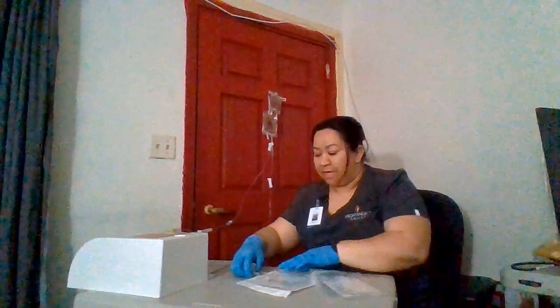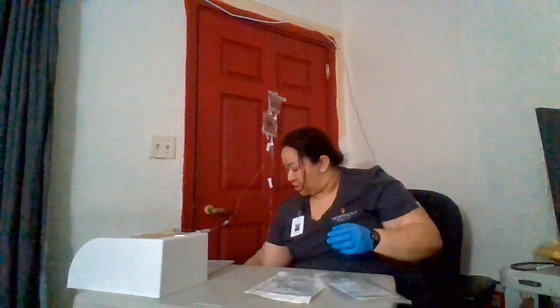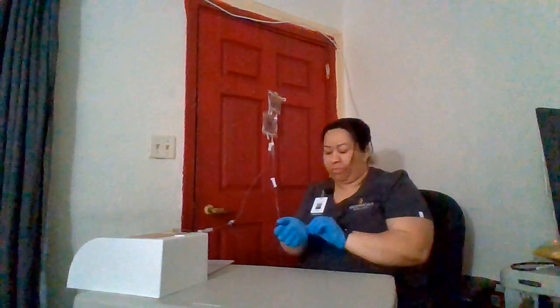I will clean up all my supplies here that were used. I will be taking off my gloves, performing hand hygiene, and now I will be finishing my documentation regarding this procedure.